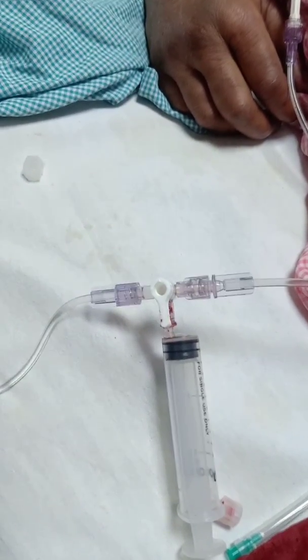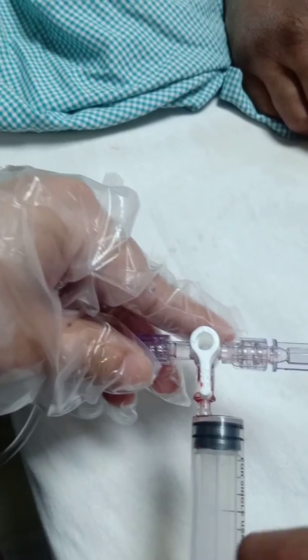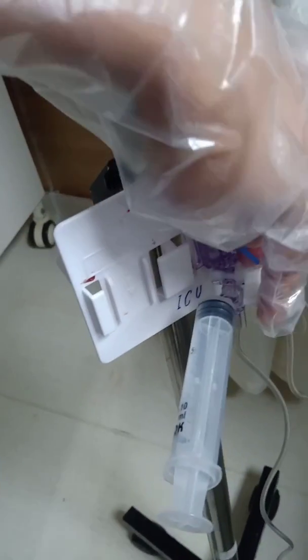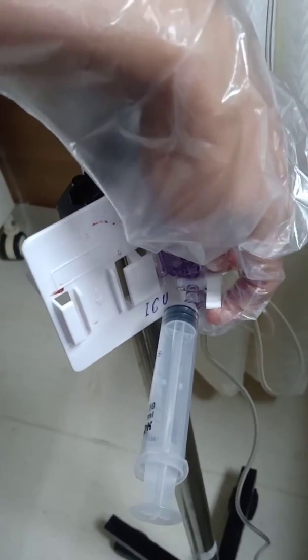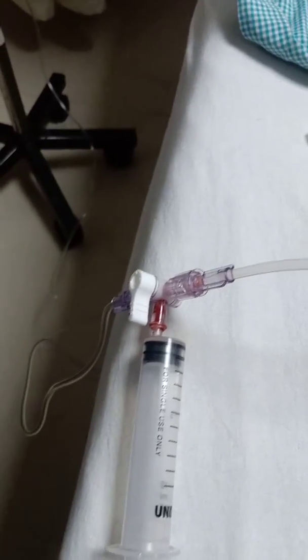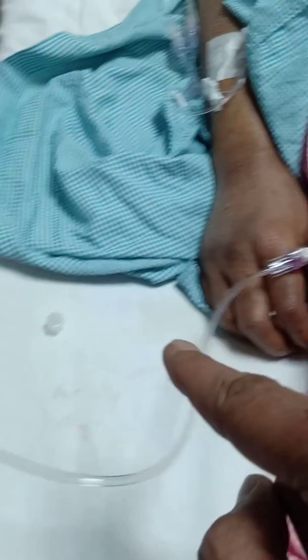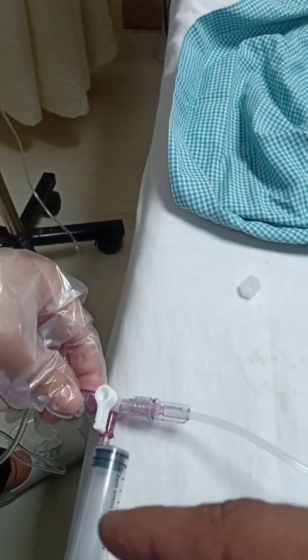To draw a sample, we place one syringe in the proximal port and keep that port closed to the syringe. We place another syringe at the further port, closing it to the transducer side and opening it to the arterial side. The proximal port syringe is where we will collect the sample. We must calculate the dead space from this point to the catheter and discard twice that volume before taking the actual sample.